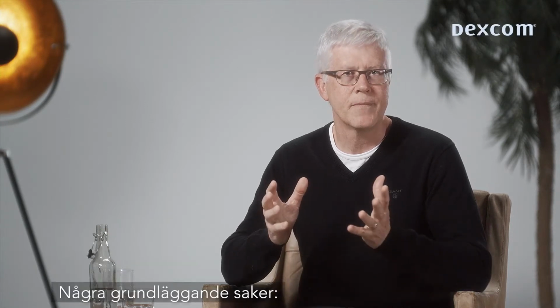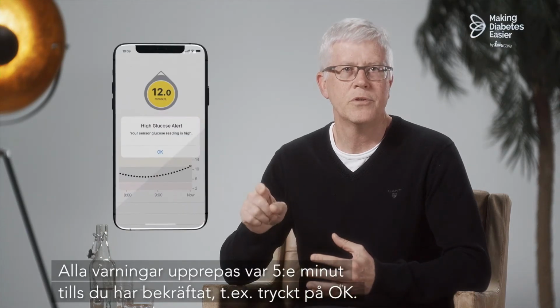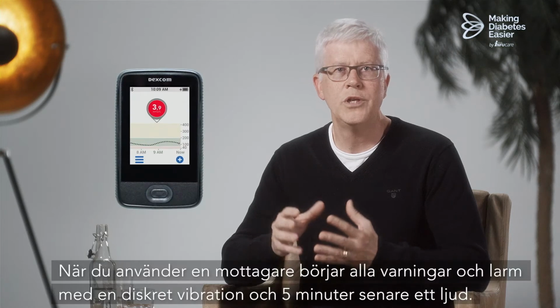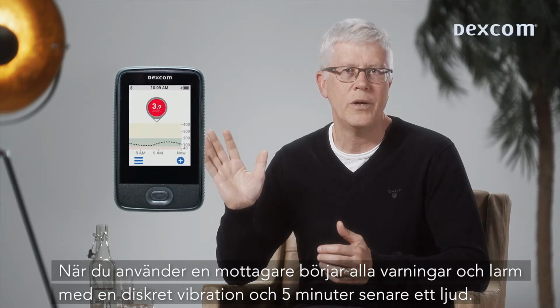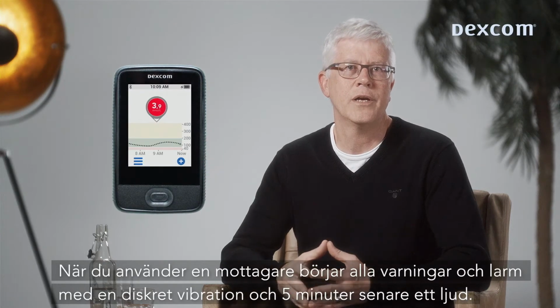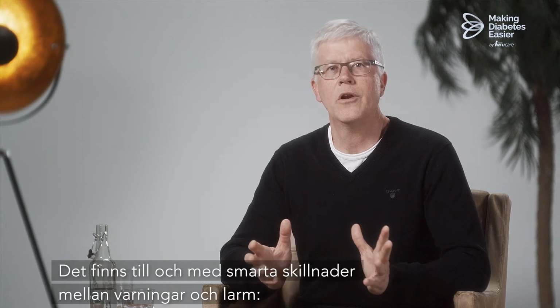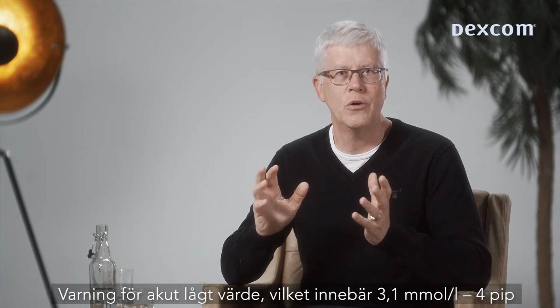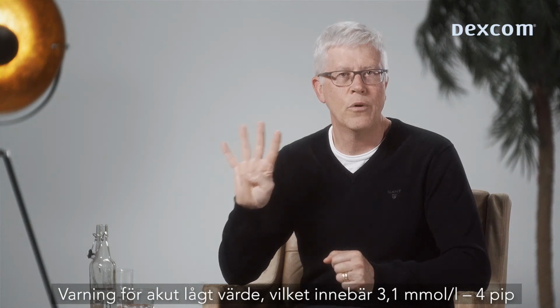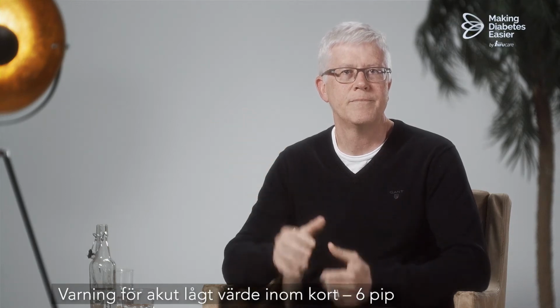And some basics. All alerts are repeated every 5 minutes until you have confirmed, pressed OK. When using a receiver, all alerts and alarms start with a discrete vibration and 5 minutes after that a sound. There are even smart differences between the alerts and the alarm. High alert, 2 beeps. Low alert, 3 beeps. Urgent low, meaning 3.1, 4 beeps. Urgent low soon alert, 6 beeps.